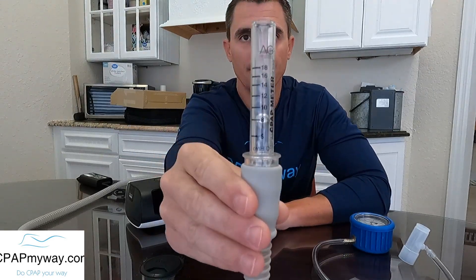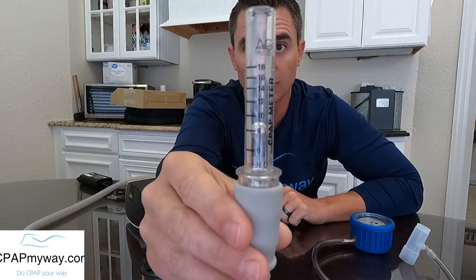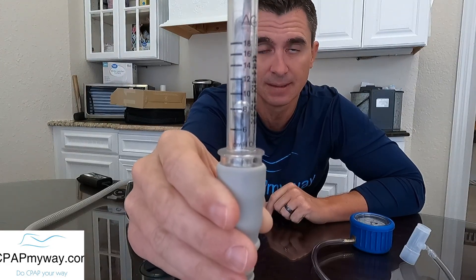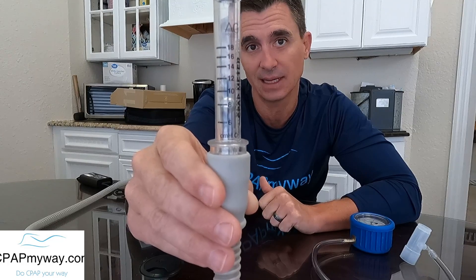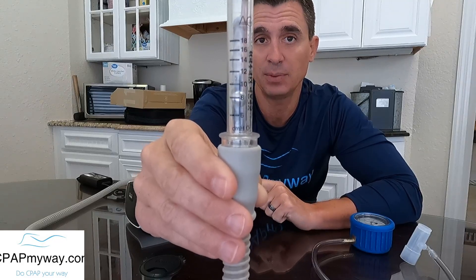To demo this, I turned the EPR in the AirSense 11 up to three — that's the maximum exhalation relief this machine is capable of. Previously the ball was up at the 10, but now we notice the ball is down near seven or eight. That's because the EPR is telling the machine that somebody is breathing on it and it needs to reduce the pressure by the EPR setting of three. So if you were checking this at home with EPR set on three, you might think the machine isn't blowing right — but it actually may be blowing just fine.